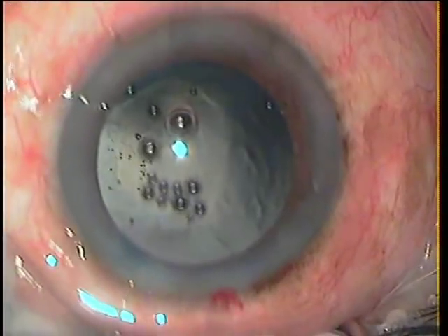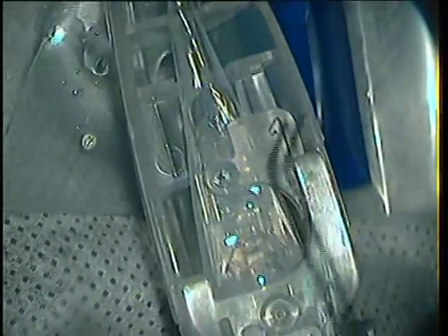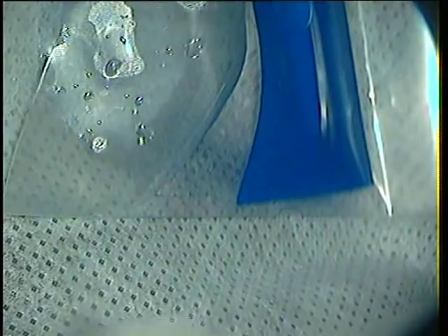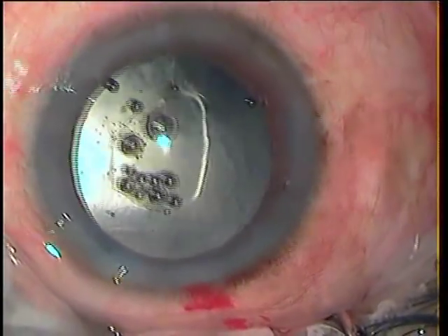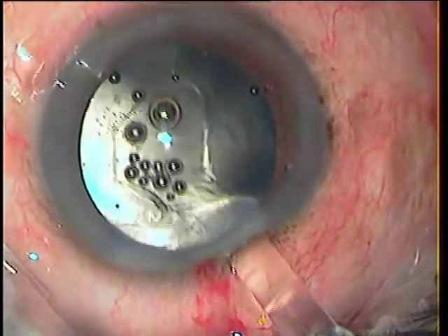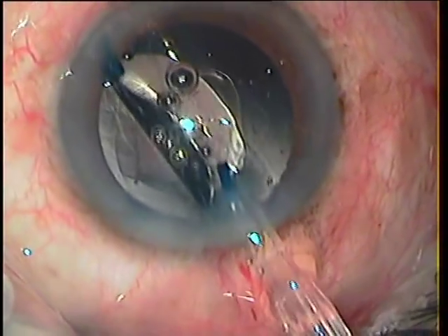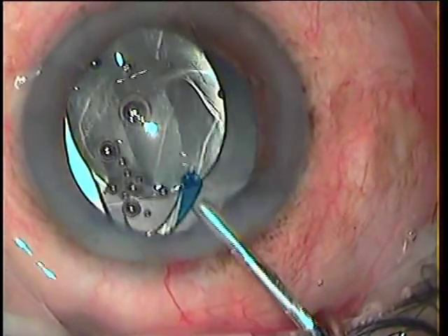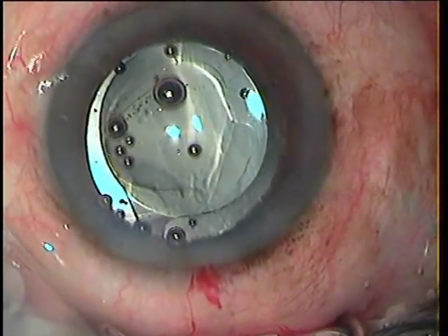The cortex removal is now complete and I will proceed for implantation. I decide to implant the regular single-piece preloaded foldable IOL — this is a Hoya lens. Most of the time I would have opted for a sulcus fixation lens, a multi-piece. But here I thought I would be able to implant it in the bag because the rent is small and is much smaller than the optic of the lens.